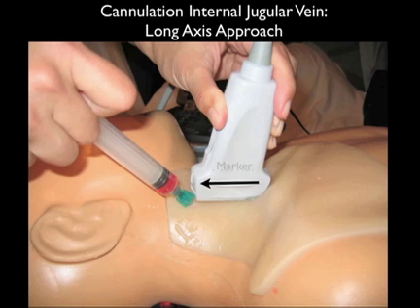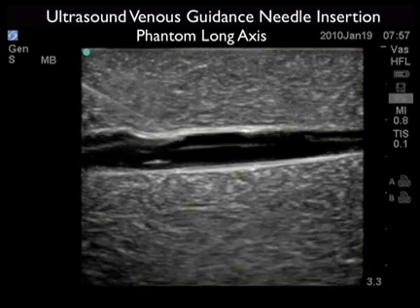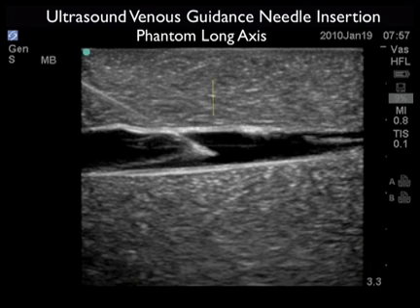Here we're performing cannulation of the internal jugular vein on a simulation model. The probe is oriented along the longitudinal or long axis course of the internal jugular vein with the marker dot distal or towards the patient's head. Here we see the needle coming in at a 45 degree angle underneath the distal aspect of the probe, allowing us to see the entire aspect of the needle as it travels from the surface all the way down to the venous lumen. We see the long axis approach with the needle coming from left to right, and note the needle tip squarely within the vessel lumen.